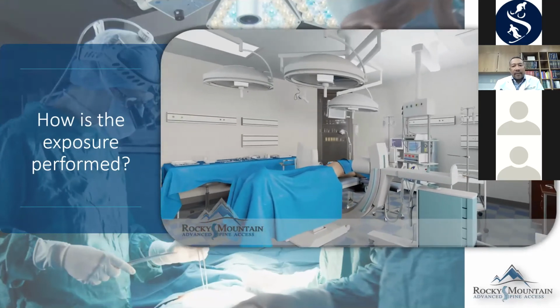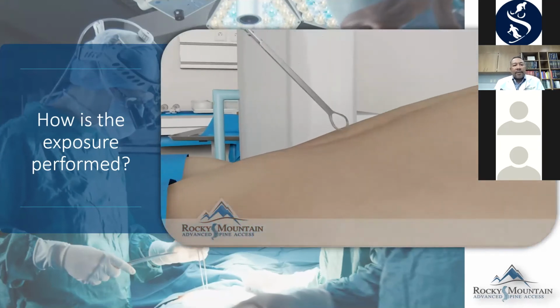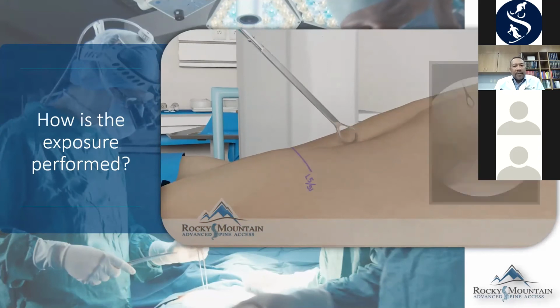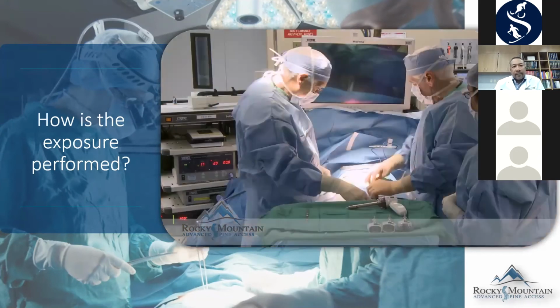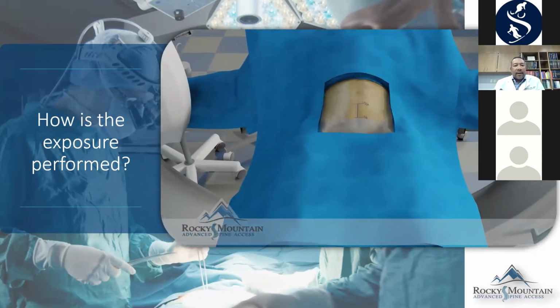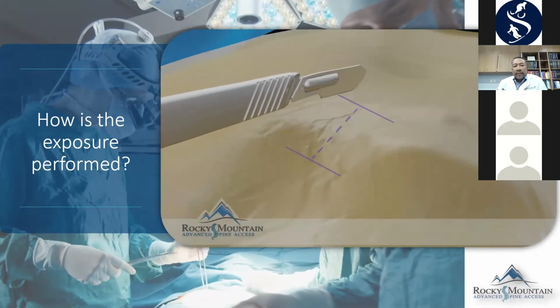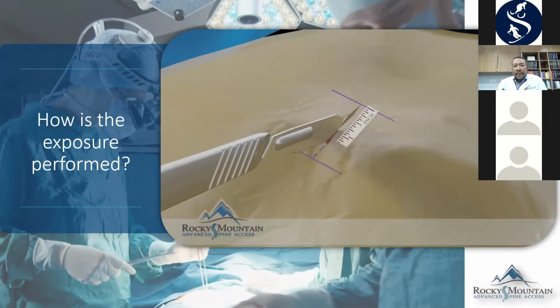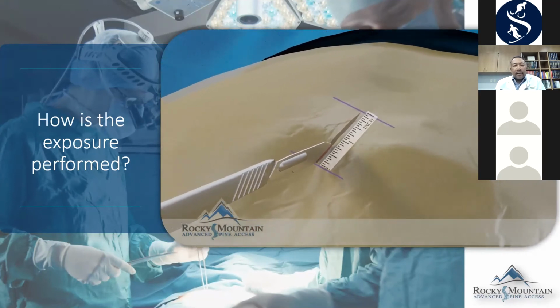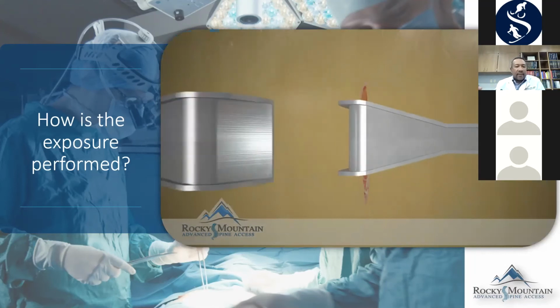There's a quick video that I want to show that demonstrates the process of approaching the spine. It's a retroperitoneal approach that's done on the patient's abdomen. About a 3-inch incision is made after the skin is cleaned and sterilized, prepped, and draped. This is a longer video. I'm going to speed through this a little bit and describe it.